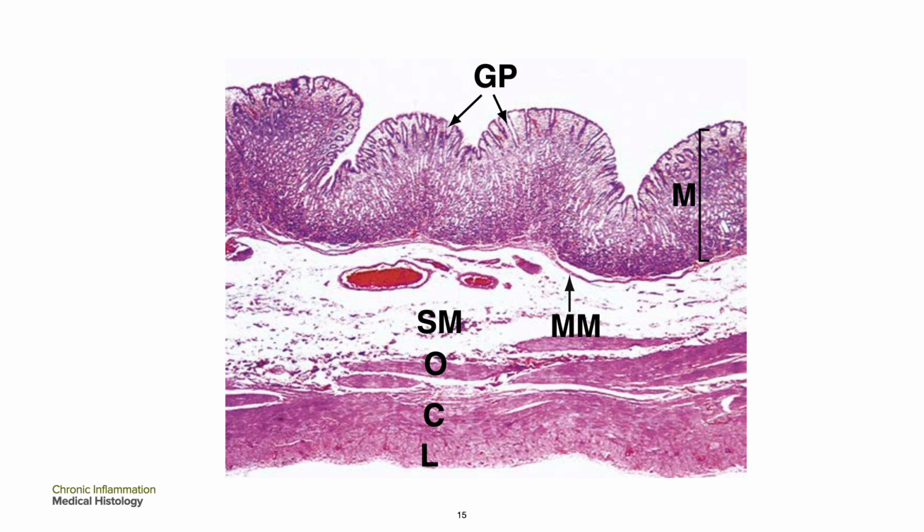The adipose tissue of the lesser and greater omentum is attached along the lesser and greater curvature of the stomach. This is not illustrated here. Lymph nodes and large blood vessels lie within this omental fatty tissue.